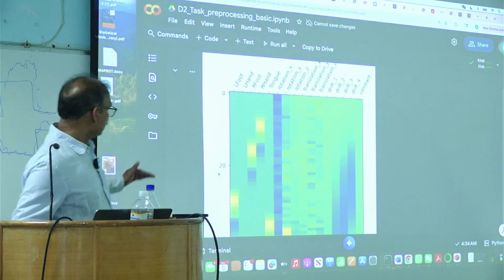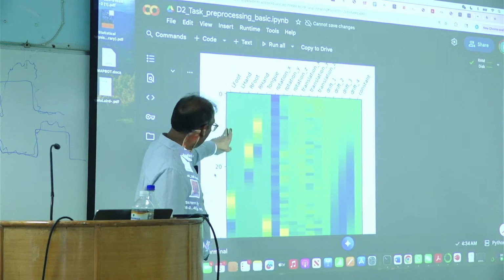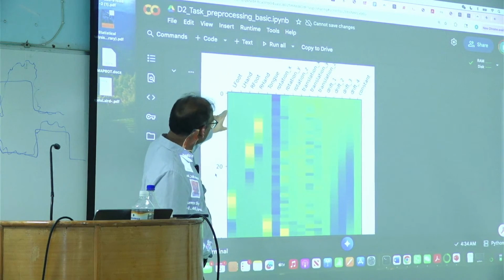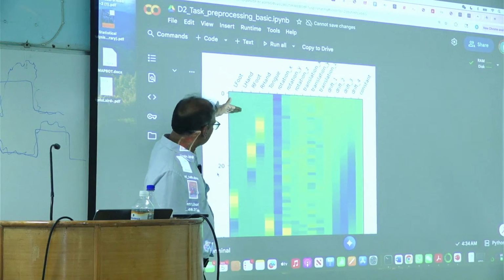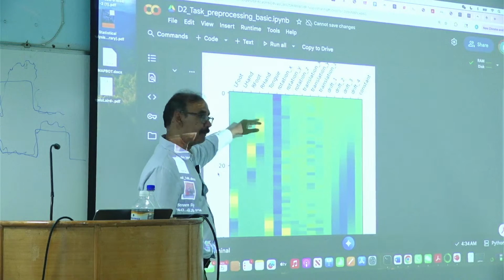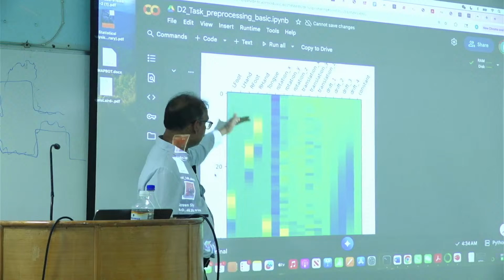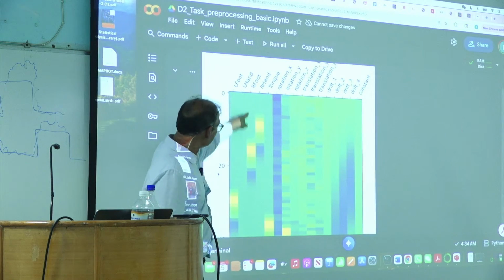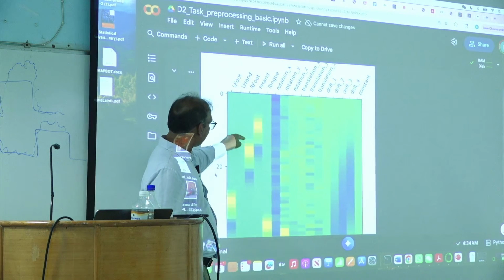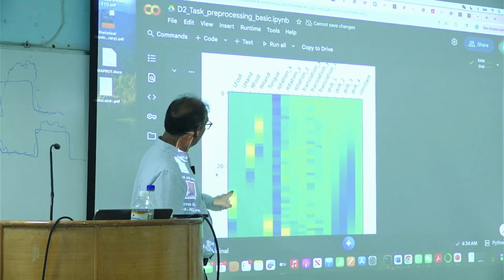So the scanning started from this time point, and first, at 7, I forget, like 12 or something, they had to tap their right hand for 17, right? And then they had to tap their right foot, and then they did left foot.